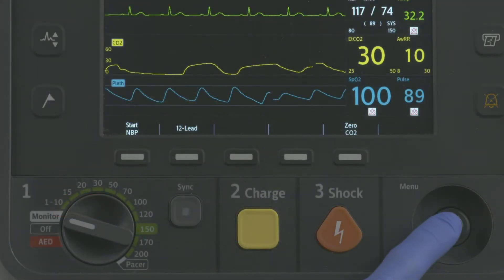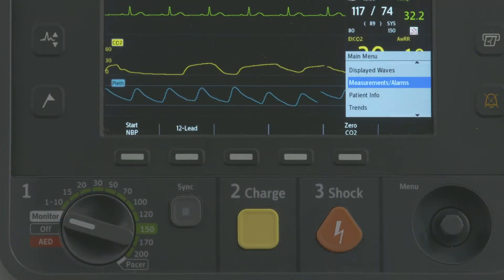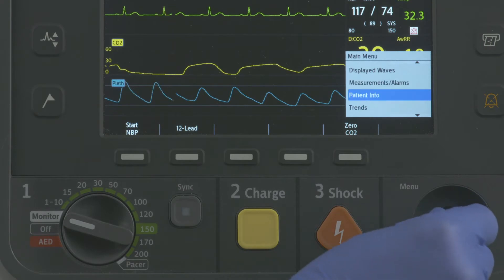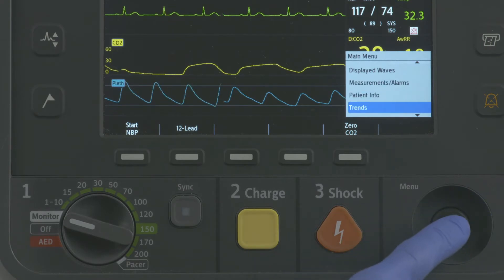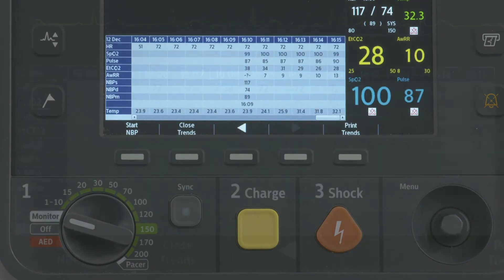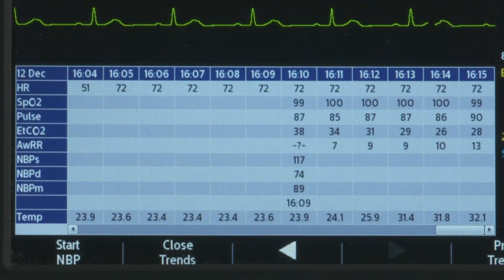Press the Smart Select knob, navigate to Trends, and press the Smart Select knob. The trending report displays here.